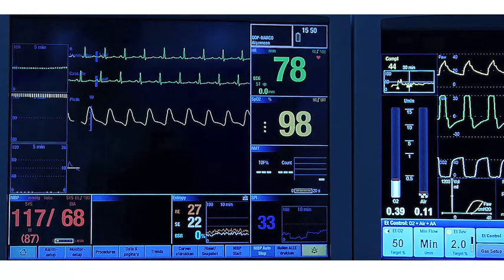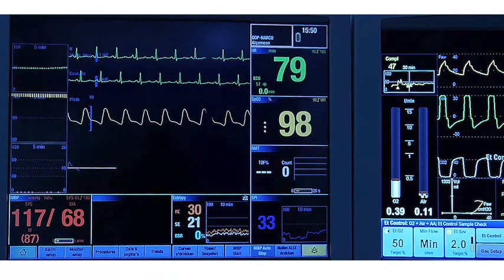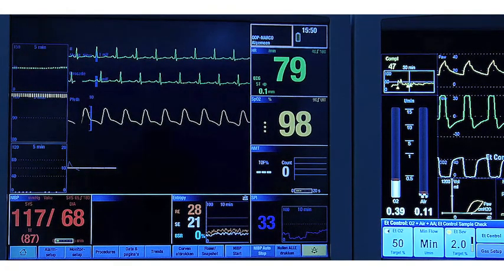And we have to wait. If you see a value from your train of four, you always have to wait for a second or a third measurement to confirm this value.